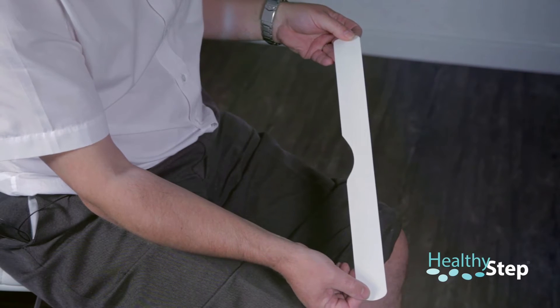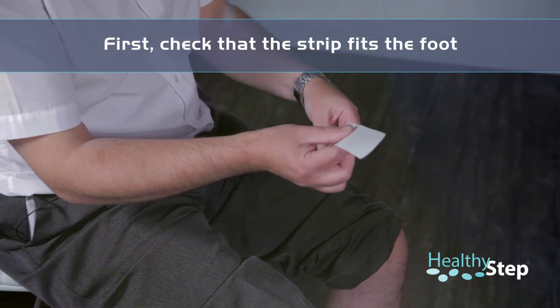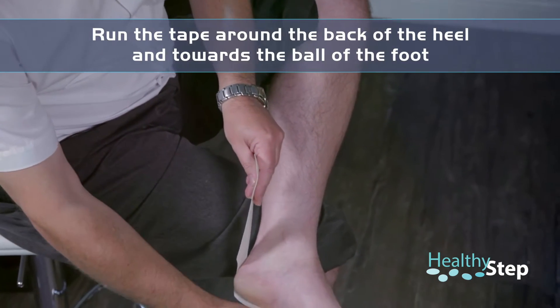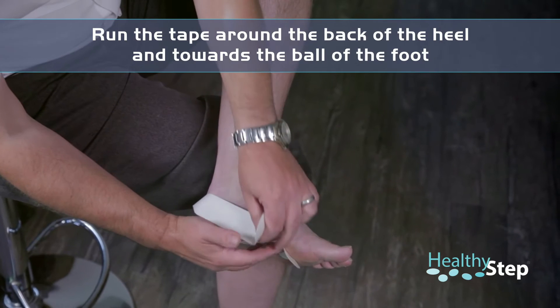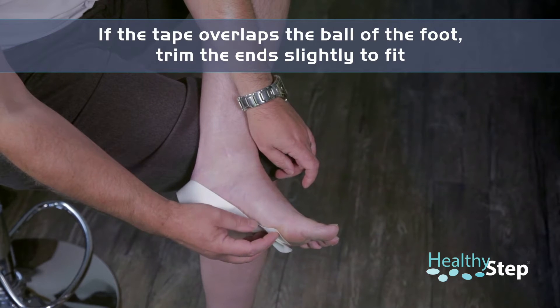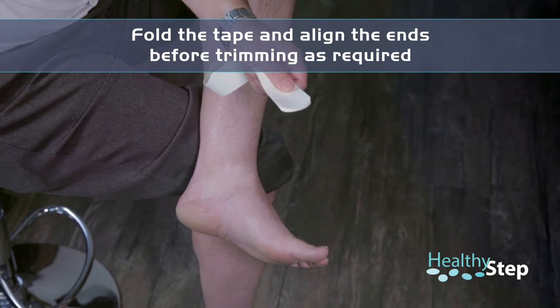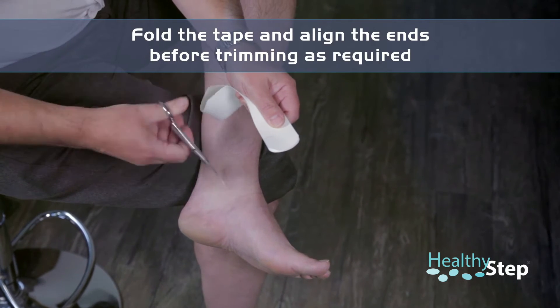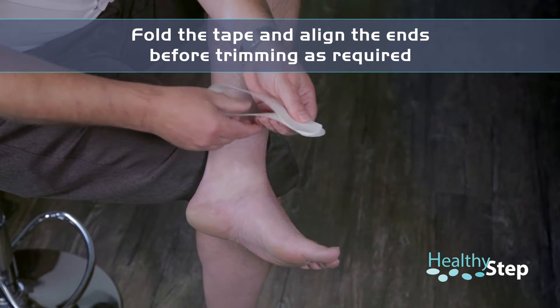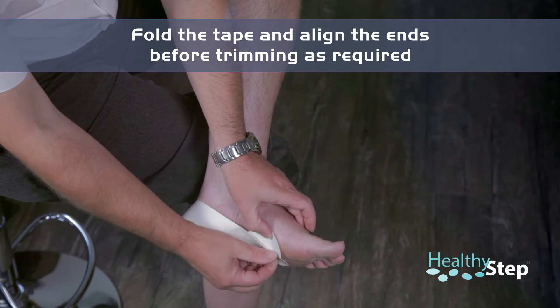Each strip should look like this, with a piece of backing on the underside of the tape. The first thing you'll need to do is make sure that this fits the foot. Run the tape around the back of your heel and head towards the ball of the foot. If the tape slightly overlaps the ball of the foot, you'll need to trim it back a little bit. To do this, fold it back on itself, align the two ends, and trim off a little as you feel necessary. Then check again to see whether it now sits behind the metatarsal heads. If it doesn't, you may need to remove a little more.